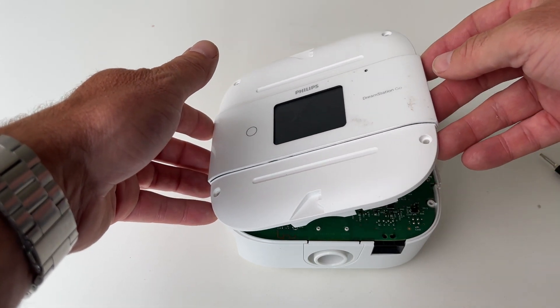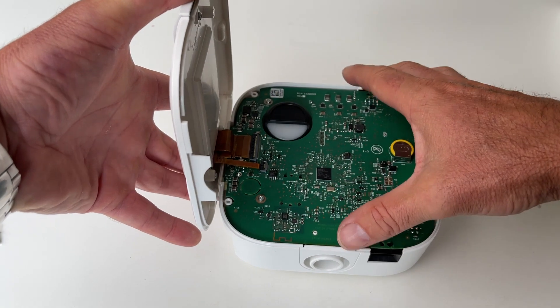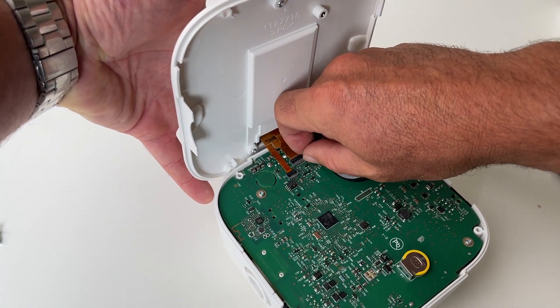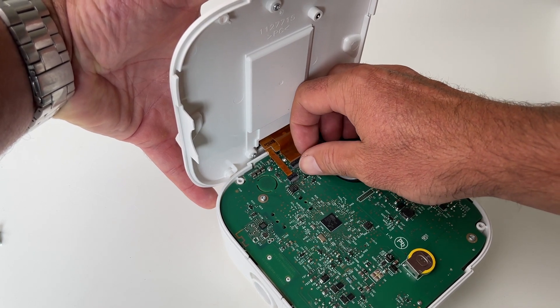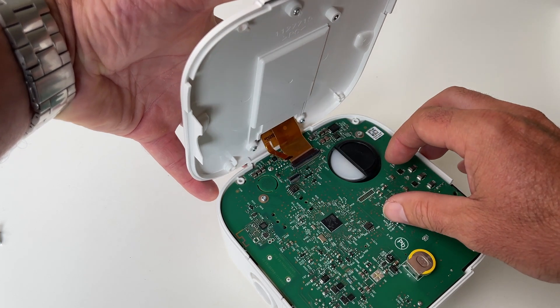Just be a little bit gentle when you're taking off the lid because it is attached — you just sort of want to peel it over to the side like this. You don't want to tear these ribbons because if you tear them your screen is not going to work. What you want to do is flip up a little latch there — you can see it — flip it up, and then this one, flip it up, and then it'll just pop out.